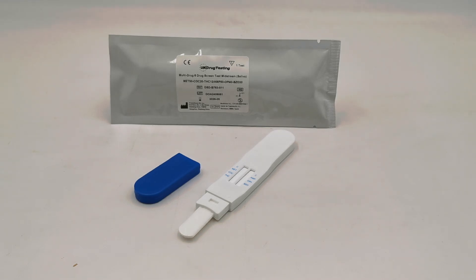Welcome to this UK Drug Testing product presentation video. This is a new six panel saliva drug test — a direct saliva test, as you can see from the packaging in front of you. UK Drug Testing branding. It contains a six drug screen midstream saliva test.